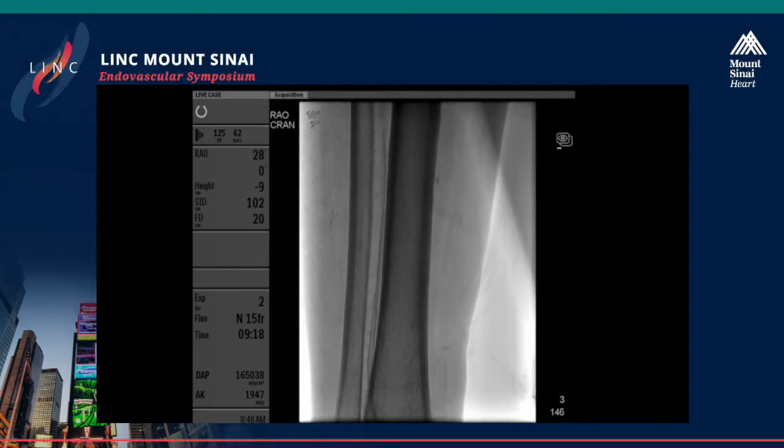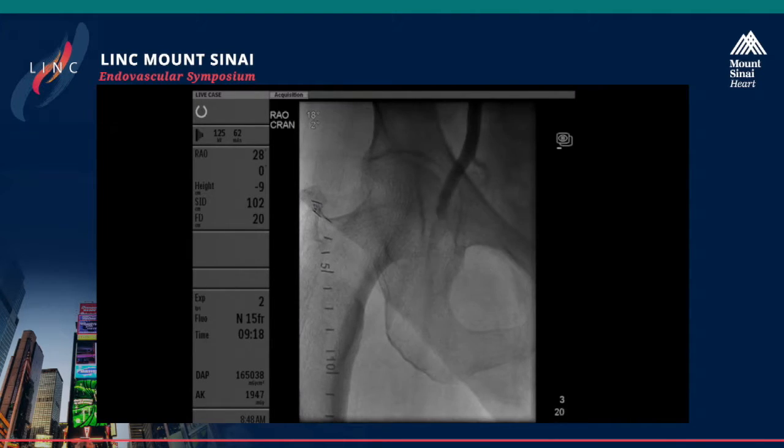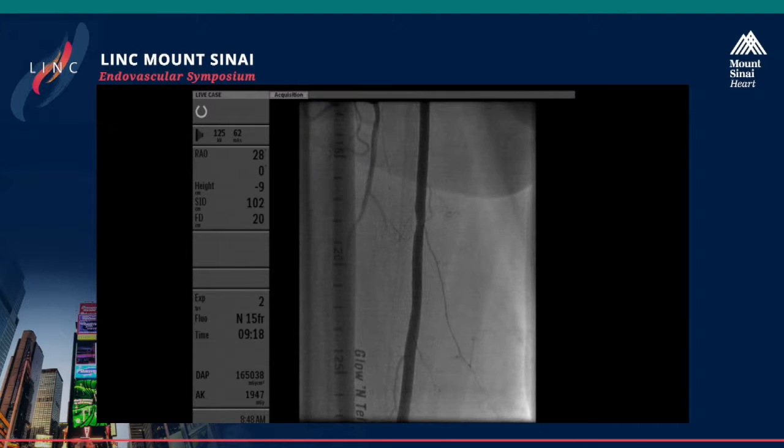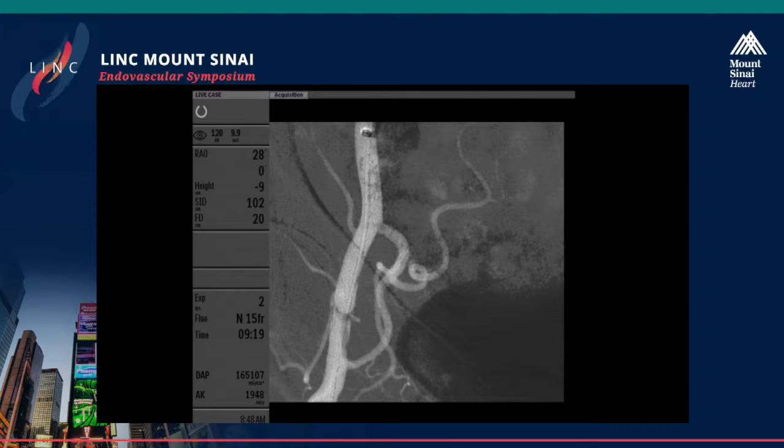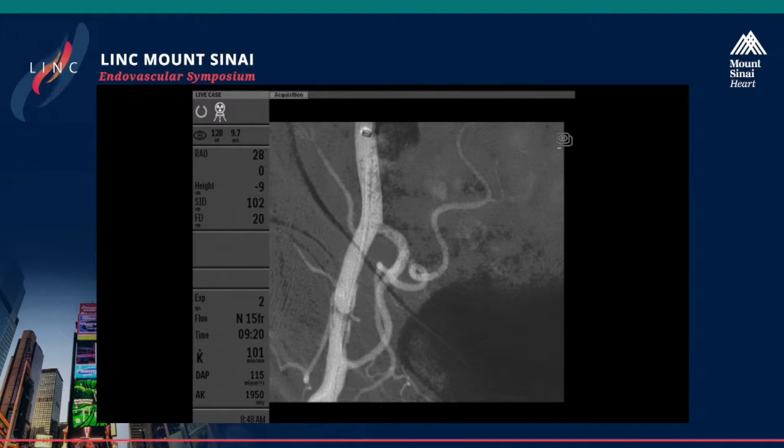This is Anwar. So it's actually very interesting. If you look at angiography only, it does look like the patient had a procedure before. It just angiographically looks that way. But I think the best approach in this case, at least what I would consider doing, is a directional atherectomy followed by drug-coated balloon.